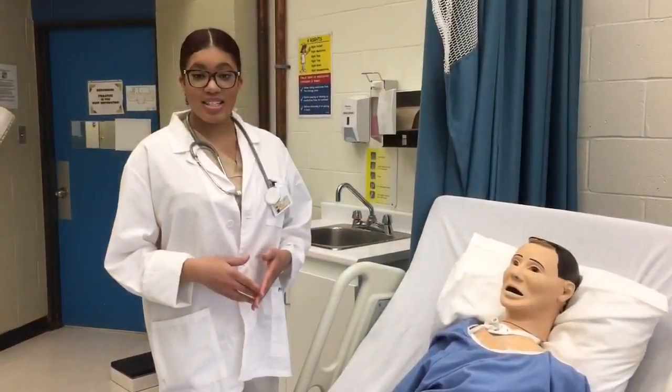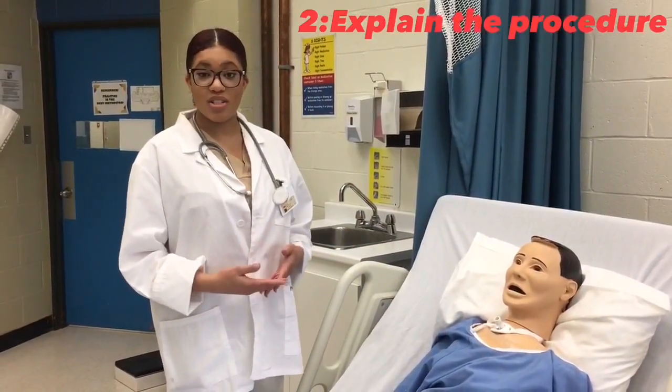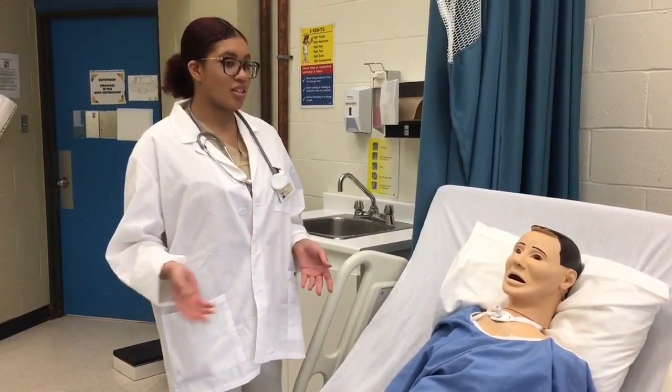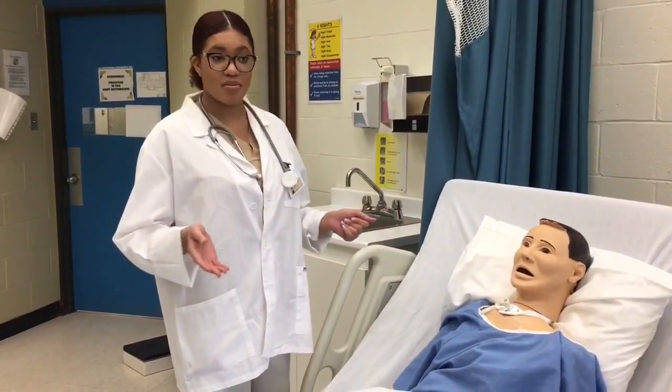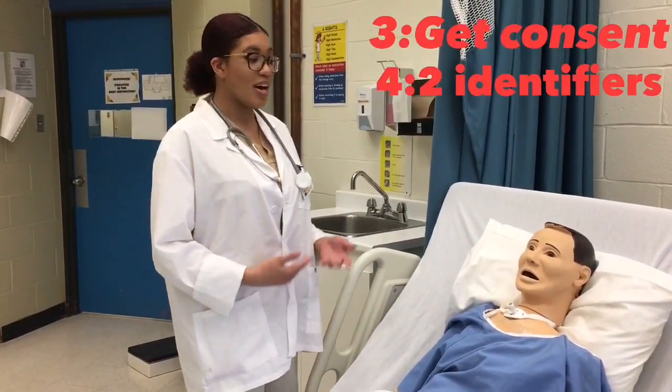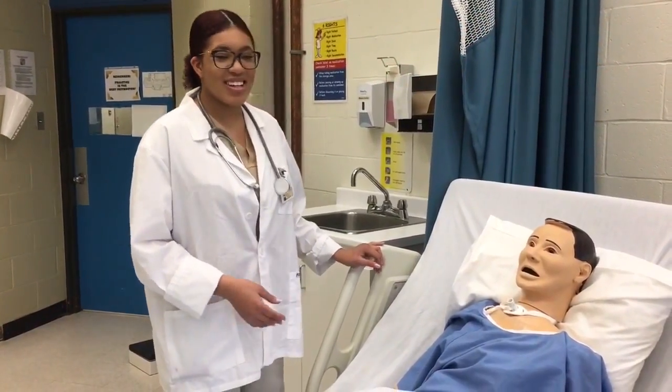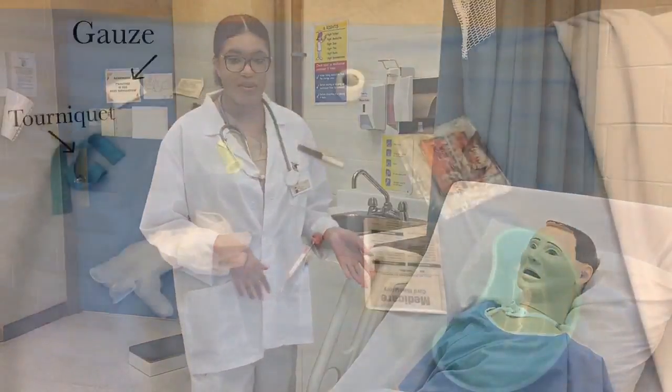The second step is to explain the procedure and what you're there for: 'The doctor ordered me to do a blood draw, so I'm going to take some of your blood and send it to the lab to get tested so we can figure out why you're sick or what's happening.' The third thing is to get consent: 'Is that okay with you? Okay, I'm going to go get my supplies and I'll be back.'